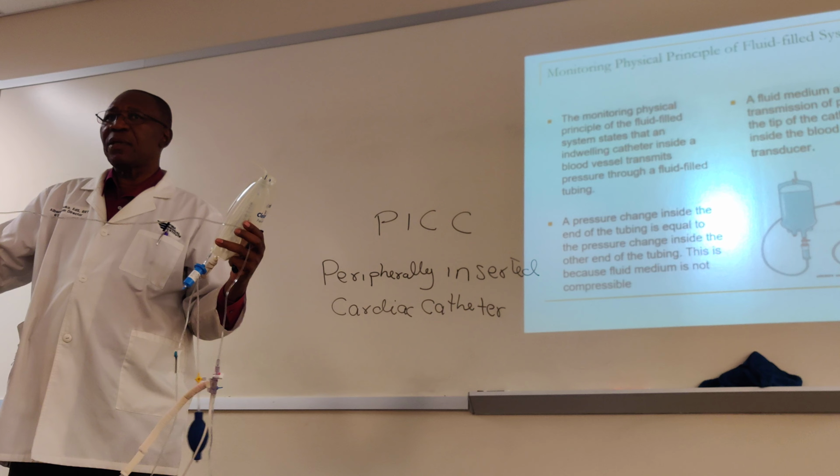Understand the components of the fluid filled monitoring system. Define a transducer. Understand the relationship between the position of a transducer in relation to the level of the heart and hemodynamic pressures.